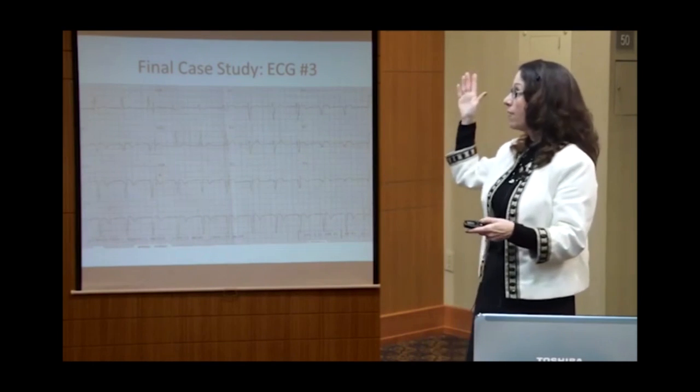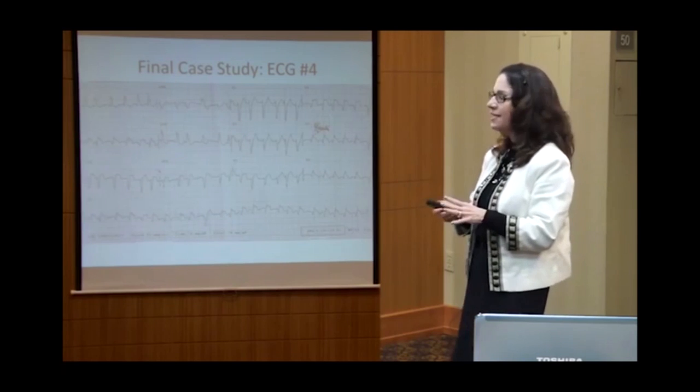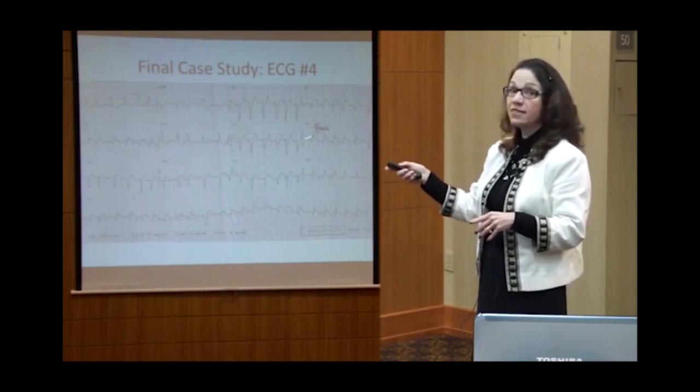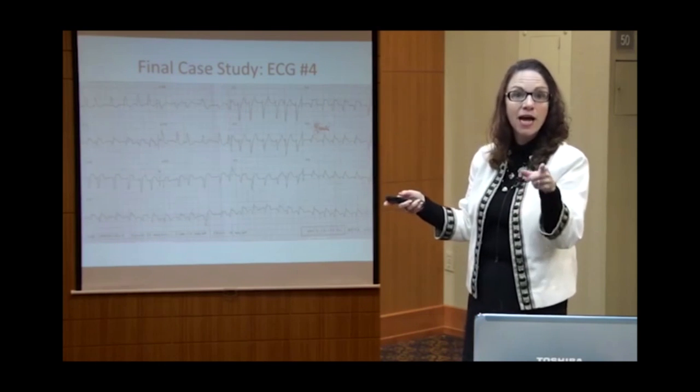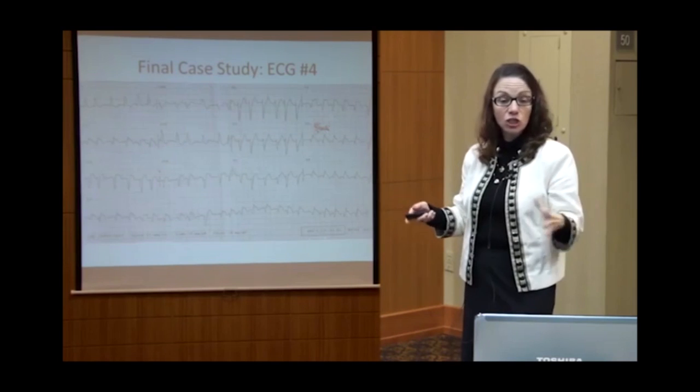And so I turned around, the monitor's right over my head, and I looked up. Now, I did not see a 12 lead, obviously, but we monitor in lead V1. Now, his heart rate is fast. And I got to tell you, I saw that. The first thing I did was put my eyes back on Charles to make sure Charles was still with me. He was awake, alert, and oriented.